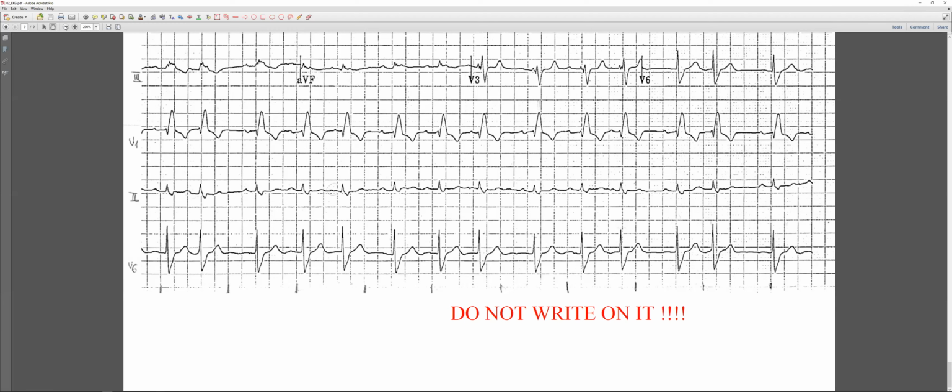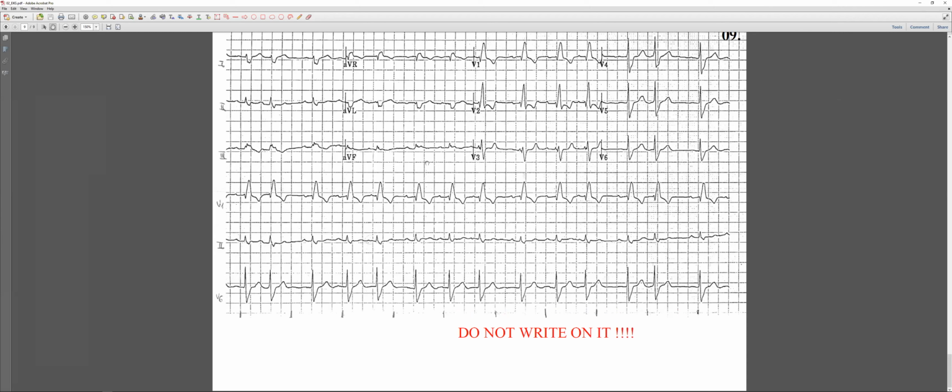Okay. Go on, because we haven't finished yet. Okay, Mickey, let's see if I can. Okay, there we go. We're slowly getting there. Sorry, I'm trying to move it a little bit further.